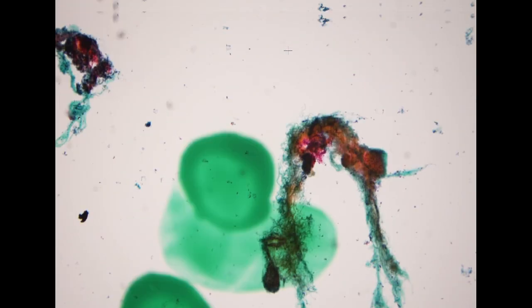So this cluster is kind of indeterminate. This is also a similar cluster. It is atypical, but we cannot make a definite call just based on this morphology.